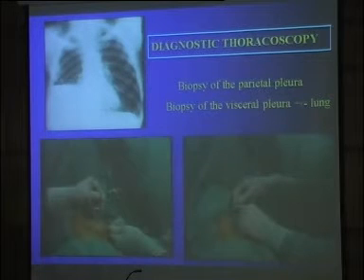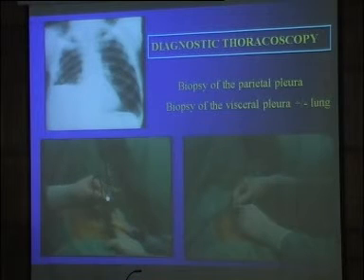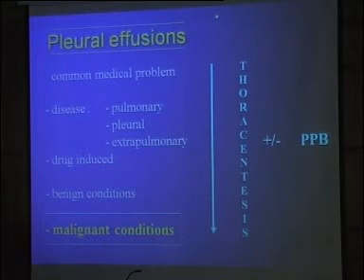The first step, you see this patient with artificial pneumothorax. The first step, of course, is to remove all the fluid from the pleural cavity. You can tap the fluid, you can analyze the fluid: cytology analysis, immunohistochemical analysis, biochemical analysis, microbiological analysis of the fluid. But you have to remove all the fluid in order to carefully analyze the pleural cavity.